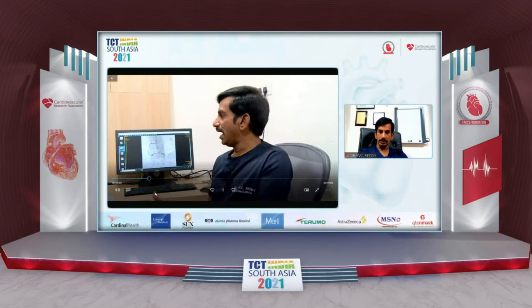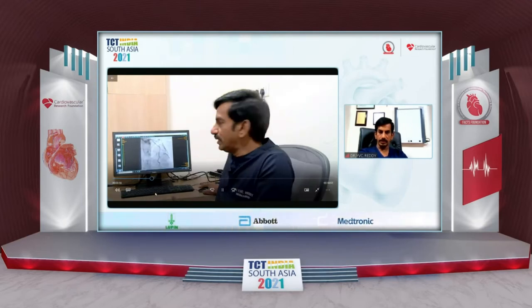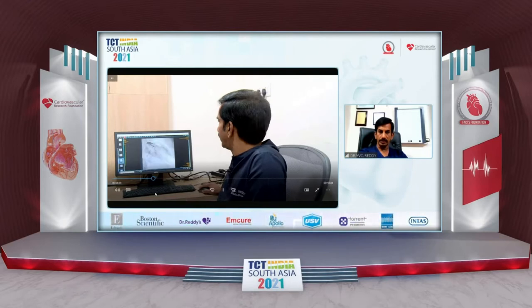So with three arms, precision in selecting the right stent and locating the stent exactly using the robotic PCI, as well as physiology by flow indices, as well as optimization by imaging using OCT. I will show you the left system as well. She has a mild mid LAD lesion with some bridging and a diseased thin caliber diagonal. And as you can see here, the left system has mild disease of the circumflex.